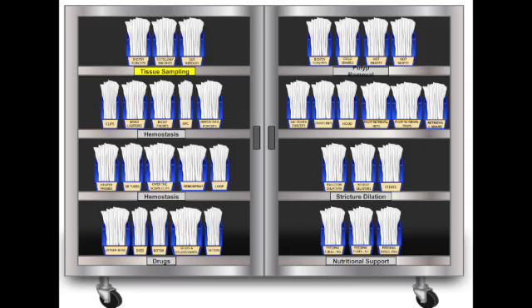Therapeutic accessories, starting with the injection needle. This seems crucial for active bleeding. What does the tech need to know? Is it always epinephrine? Good question. No, it's definitely not always epinephrine. And that's the challenge for the tech, knowing the likely pathology guides what you prepare.